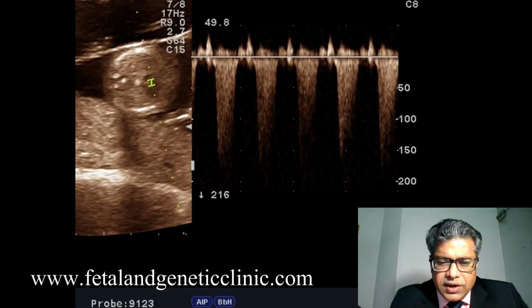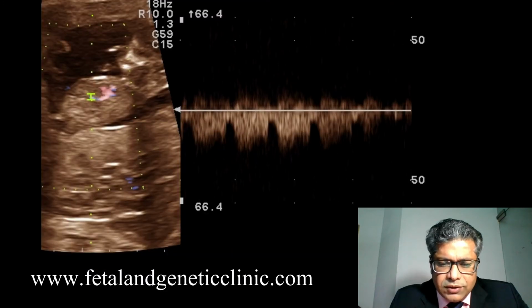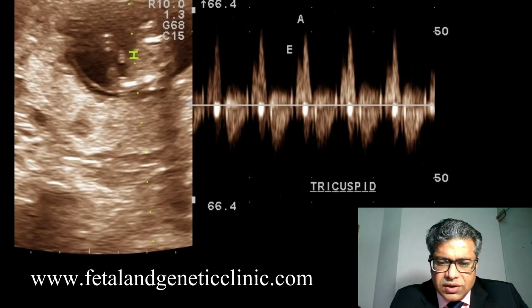This is a holosystolic abnormal tricuspid regurgitation, right? So this is tricuspid dysplasia. This is one case. To start off, the NT was 6.49 millimeters. Ductus venosus is normal. Then we evaluated and identified that the nasal bone is absolutely great. This baby has undergone some investigations and they have turned out to be normal.